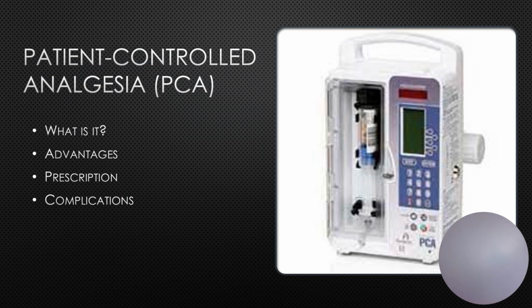So then we move on to patient-controlled analgesia, or PCA. This is going to allow clients to control IV delivery of analgesia. The client basically will push a button and receive a dose of analgesia. There is a timing unit that imposes a lockout time between doses, and this will help prevent overdosing. So, in other words, the client will not receive any medication during the lockout time, even if that button is pushed. So basically what I'm talking about is the lockout time may be every 10 minutes. That's programmed into the machine.